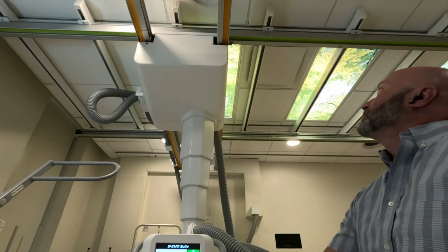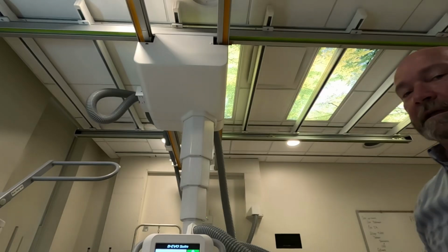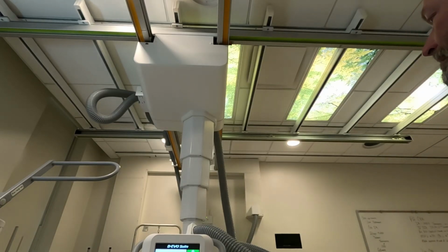And since we're set up for chest X-ray, it was a little bit hesitant, but it did finally lock in at 40 inches. So if your tech says, I want you to lock the tube in, that's what they're referring to. I want you to lock the tube in means that they want you to put it in a preferred detent.